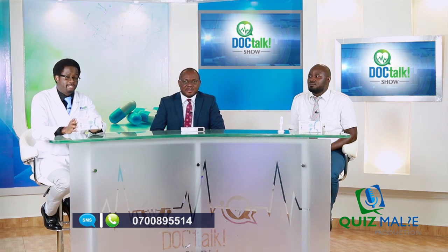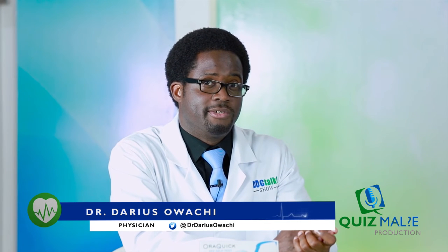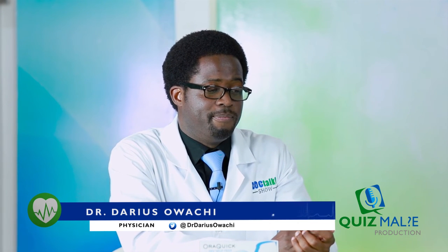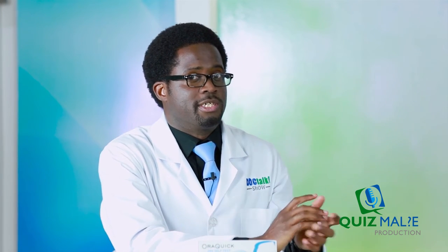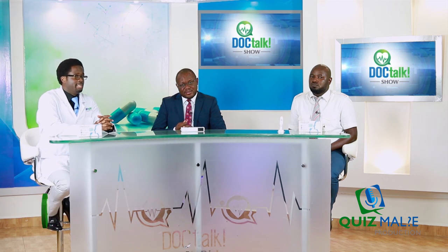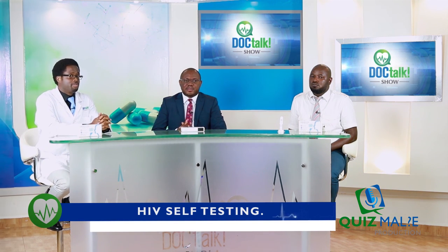Our guests have explained the importance of having a self-kit, and you can see it's very easy to use, very easy to interpret, but the steps after receiving your results are very crucial. If the results are positive, it is important you go to a hospital and get retested so that we can really ascertain whether the result provided is actually true, or it was maybe a false positive result. And he has also highlighted that the test can be done in different age groups, to as low as children 2 years and above.